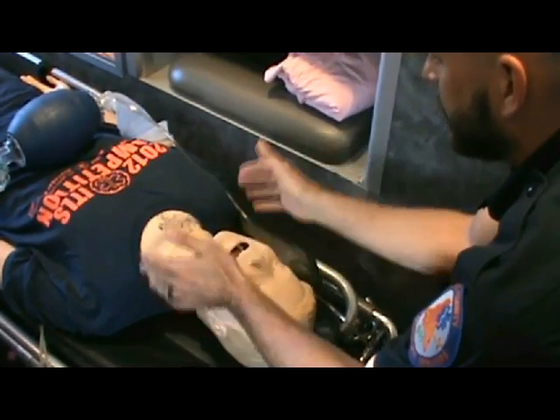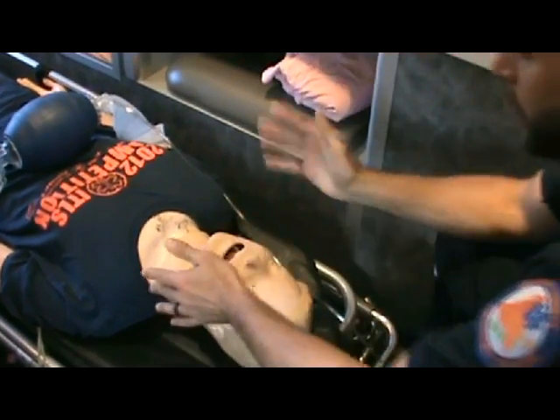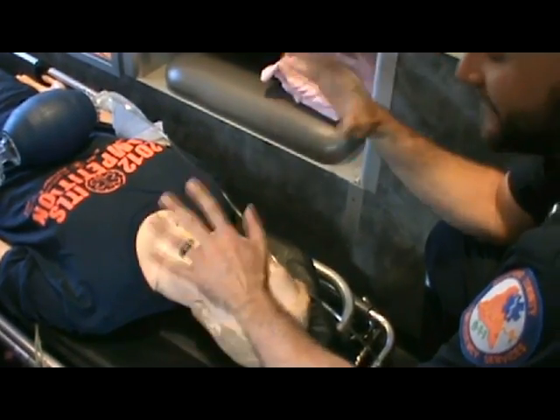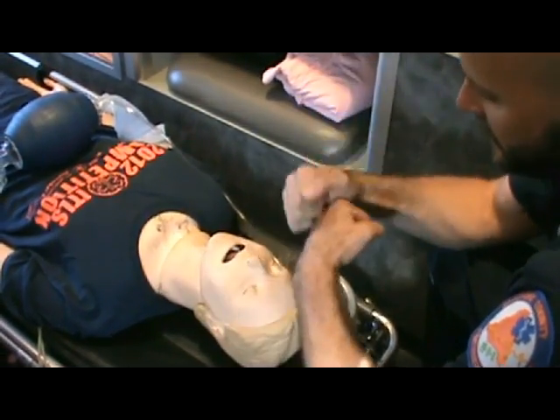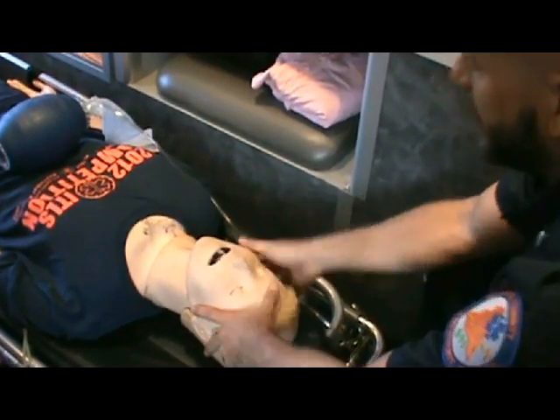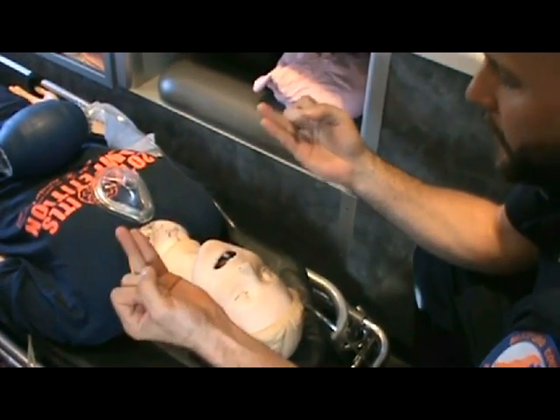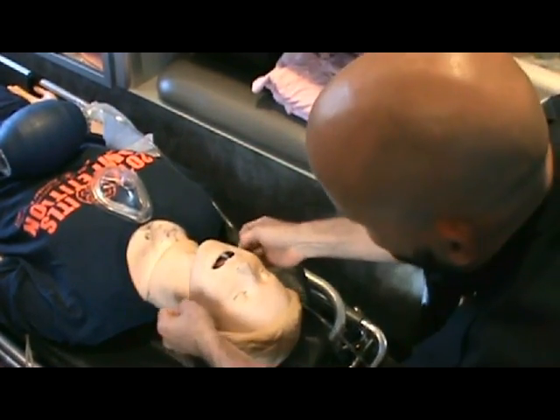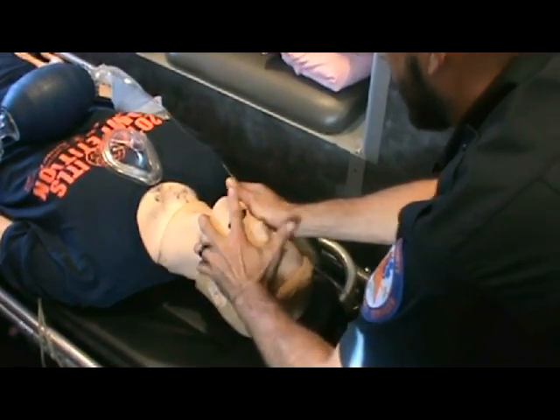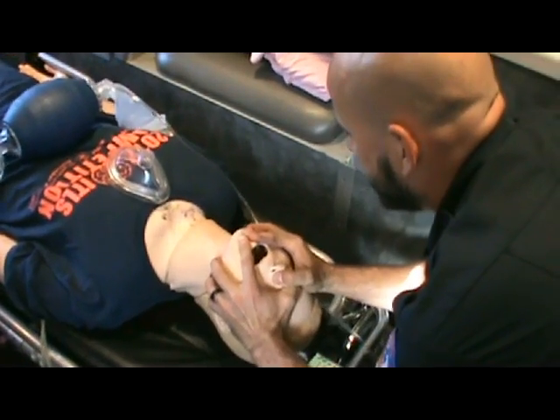How do we get the best airflow down into the trachea? We've always been taught head tilt–chin lift if no spinal injury is suspected, or jaw thrust. But don't pick and choose — if there's no spinal injury, do both. Take your ring and pinky fingers on either side and place them back on the TMJ, press up, hold the mask, take your index fingers to open the chin, then do a head tilt–chin lift.